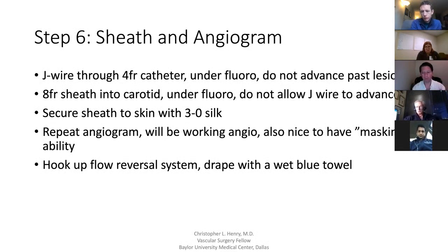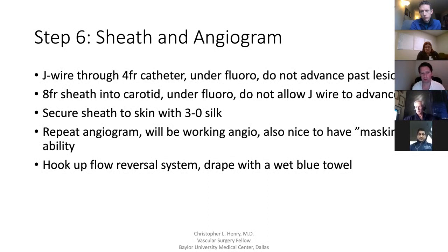Once you have the sheath in, secure it with a 3-0 silk to the chest so it is not moving, not coming out. Then the next angiogram you do will be your working angiogram. The mask or road-map feature is a really nice feature that our rad techs are getting better at doing on every case — it's helpful when running the microwire up. Hook up the flow reversal system and drape it; we put a wet blue towel over that so it doesn't slide off the table.